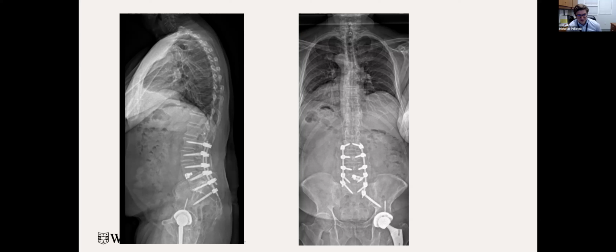I'll show you a case later on to partially answer the other question, but for the sagittal plane cases, I try to basically lay the rod in as much as possible, and I'll show another step I've done with implementation of implant changes that to some extent have changed that partially.